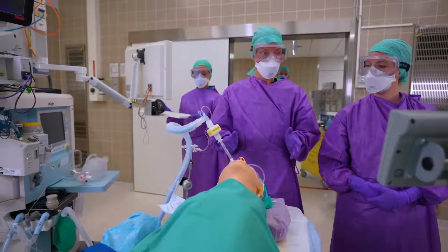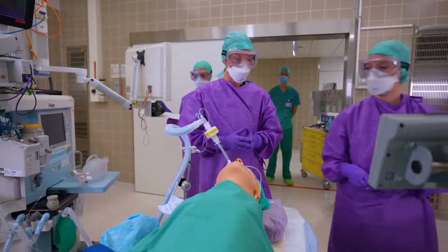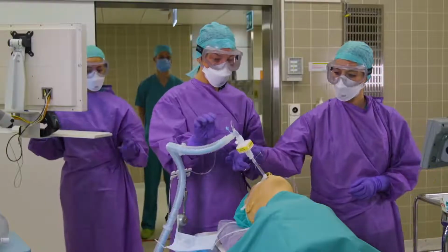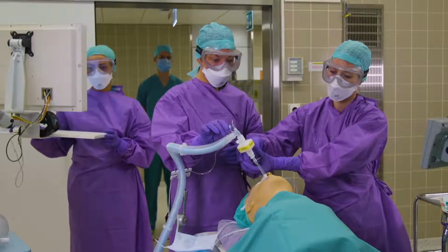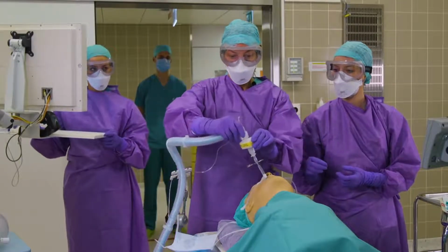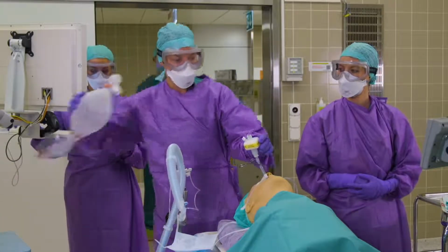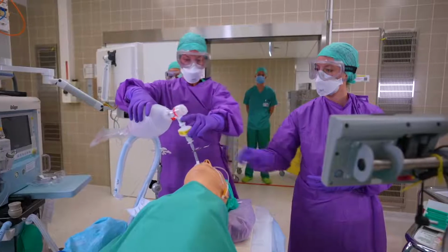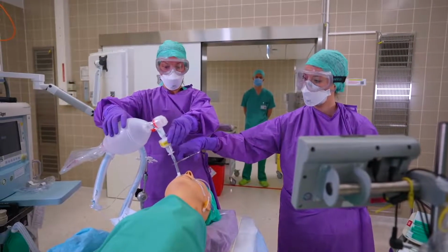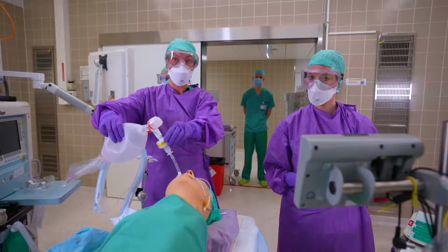If you're transporting an intubated patient to the ICU, make sure that you clamp the endotracheal tube in inspiration before you disconnect and reconnect to your bag valve mask. We are saving our transport ventilators for use in the ICU, and hence currently we are utilizing bag valve masking for transportation of ICU patients.